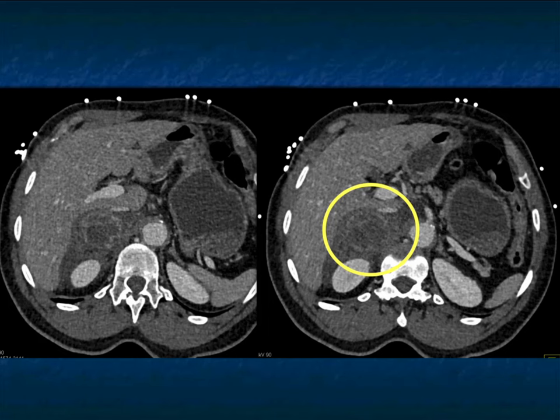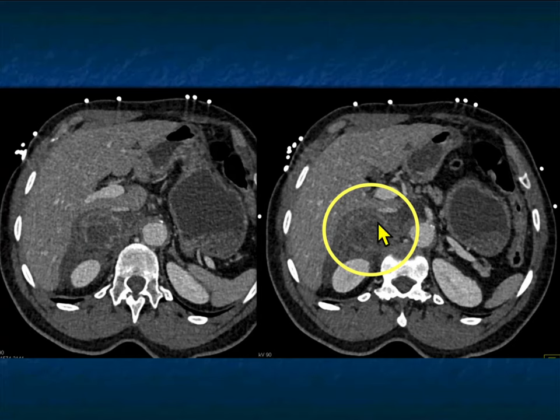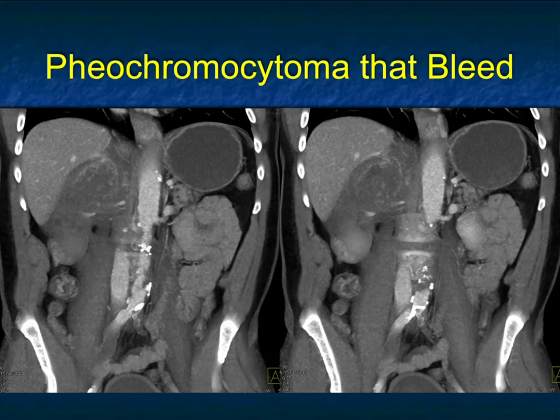When you look more closely at the venous images, you can see what appears to be an enhancing lesion within the bleed. So now we know there's a mass, this lesion probably ruptured, and peripheral enhancement indicates active bleeding. That's when you think about a pheochromocytoma. We said the primary tumor that bleeds most frequently will be a pheo — and this is a good example of a cystic pheo that basically ruptured and bled.